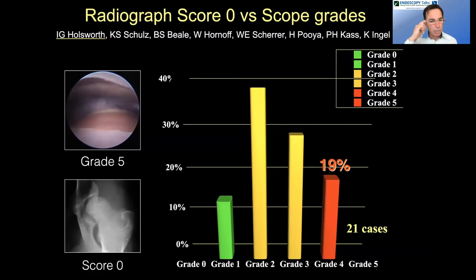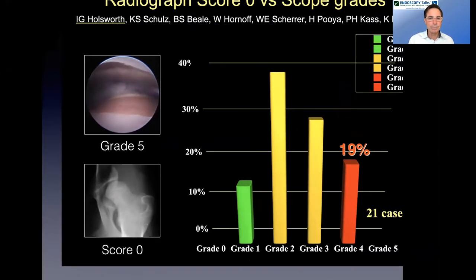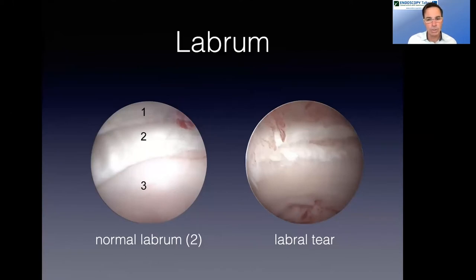So we know if you look at a radiograph, it's fairly unreliable. There was a study that was put out in the early 2000s that looked at dogs that radiographically scored normal in their hips, but these were juvenile dogs and they had a positive Ortolani sign. Well, in this study, we compared the radiographs that had a score of zero, meaning a normal hip as read by a radiologist, to their arthroscopic score. And we saw that many of these dogs that had a normal hip read out on radiographs had extensive changes within the joint. So what that tells us is arthroscopy is a much more sensitive indicator of the environment within the joint. So I use arthroscopy in any dog that I'm going to do a DPO on.